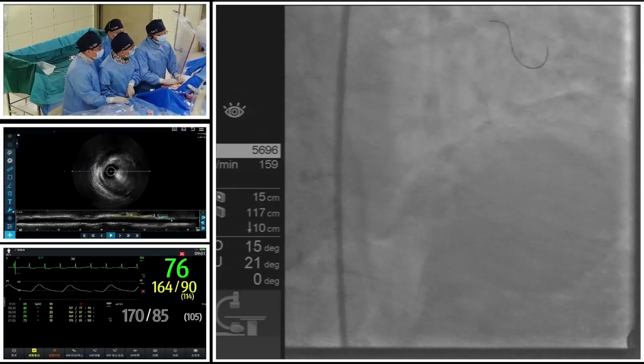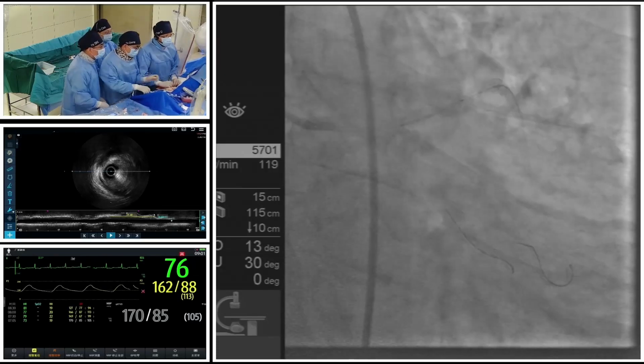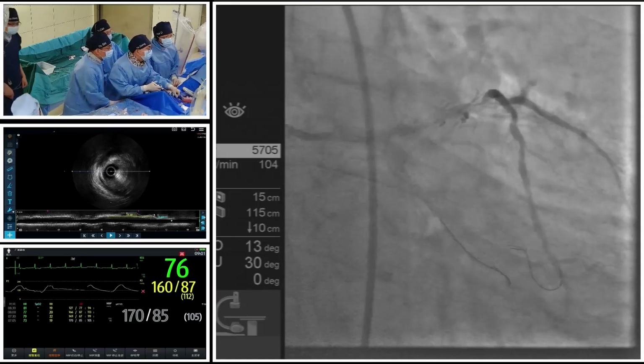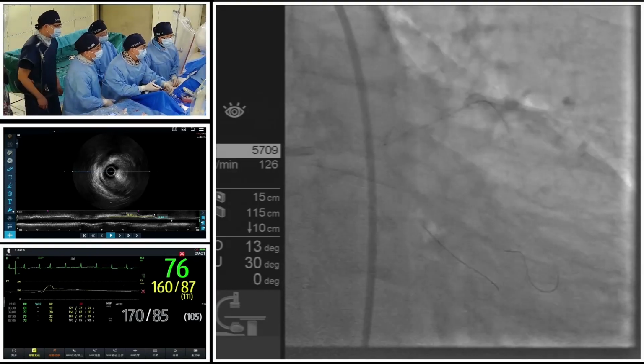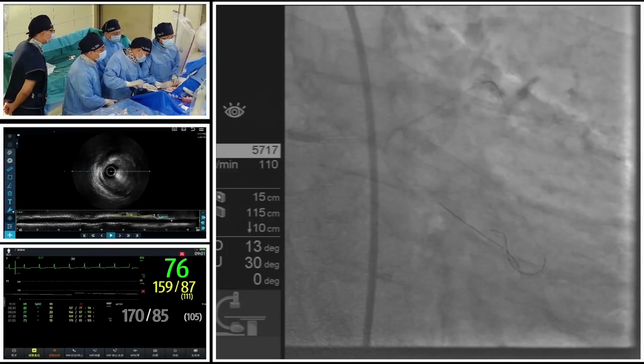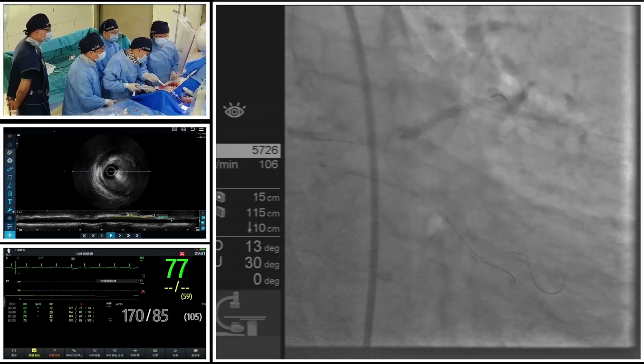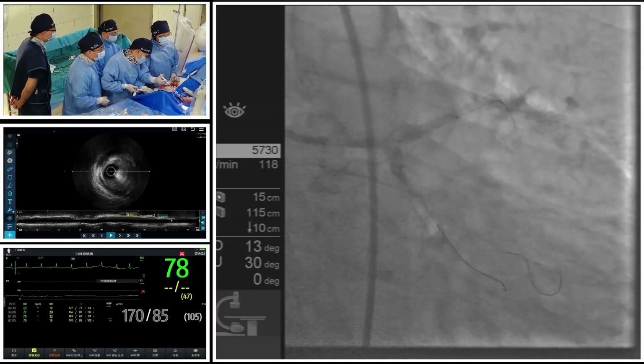Severe coronary artery calcification remains challenging during PCI and often requires one or more advanced calcium modification tools. The combination usage of rotablation and IVL can help us to better solve the problem of the calcifications.